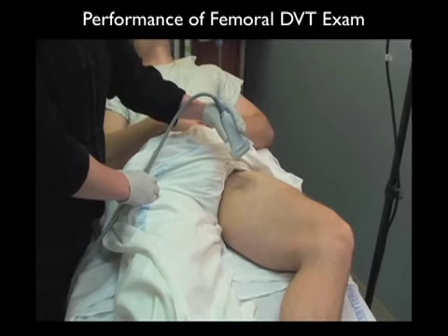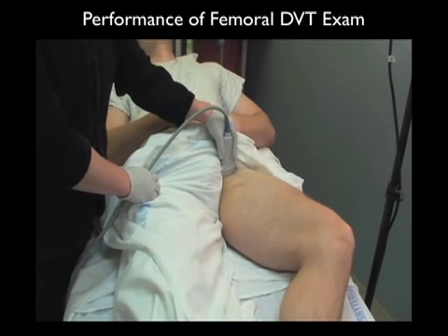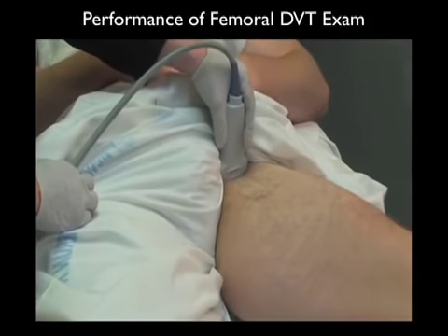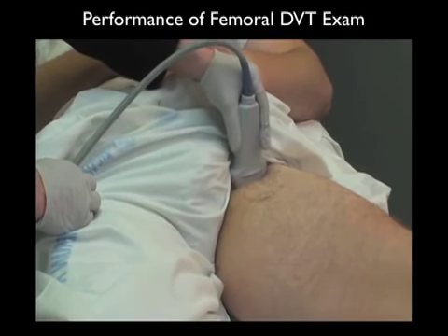Let's now watch a video and learn how to perform the ultrasound examination looking for a DVT within the femoral vein system. We begin by placing the high-frequency linear array type probe. It's the same probe that you'll be using for vascular access in a side-to-side orientation over the common femoral vein and artery just below the inguinal ligament.